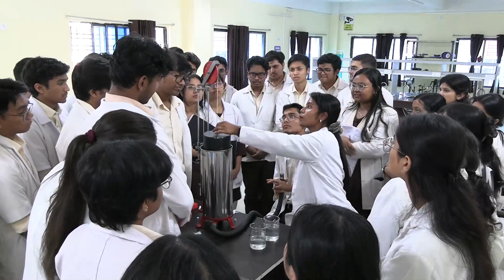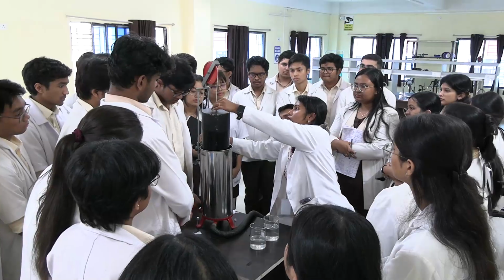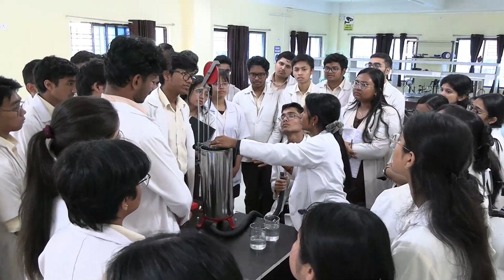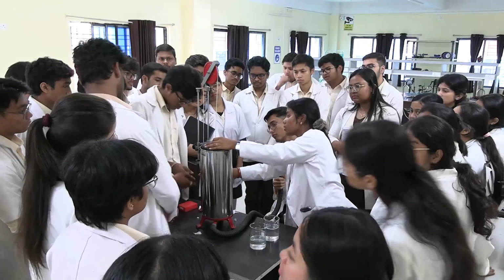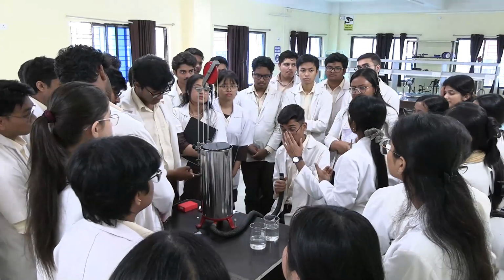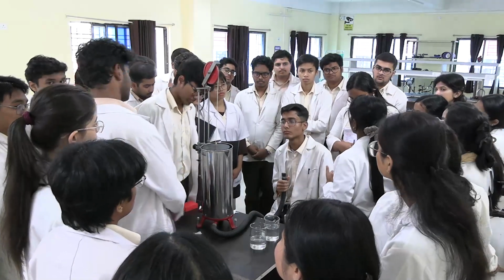Wait, yes. It is not going beyond 4,000. I think there is some problem with this. Okay, so this is how you do. You know the procedure, right? Yes. Maximum inspiration. I think there is some problem with this pulley or something. Okay, it's not going beyond 4,000. So this is how you have to do it in sitting and in standing. Some values will definitely change. Sitting it will be lesser compared to the standing. So that is the effect of posture on vital capacity.